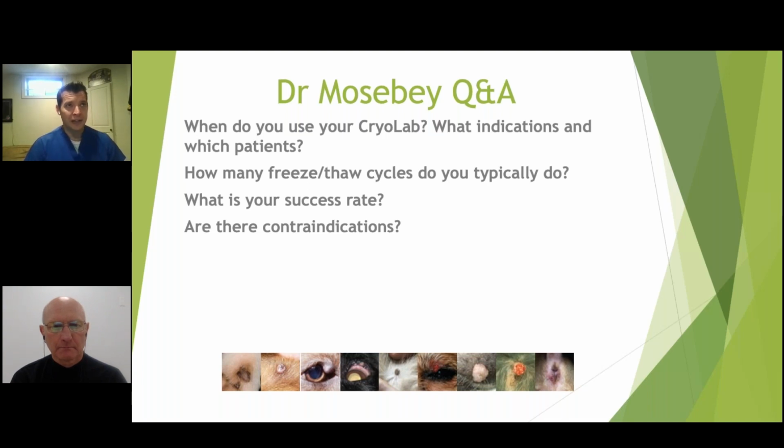Unless your clinical suspicion is, hey, I think this is something that may not be benign, or something we would be better off totally removing and biopsying, I think a lot of these lesions are nuisance lesions, and we know what they look like. We usually have a history on how long they've been there and how they've aged. So most of the things we do, I feel pretty good not doing histopathology. Some things I'm suspicious of, like histiocytomas, I aspirate just to make sure it's not a mast cell tumor that's looking a little different than the average one.